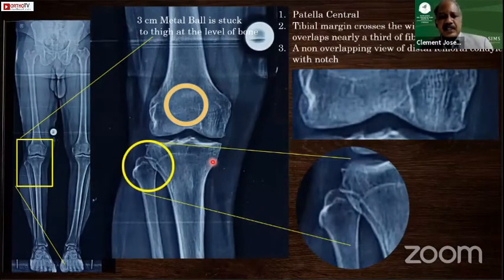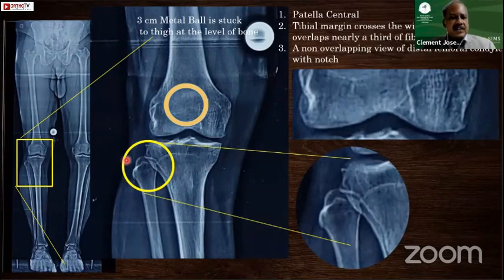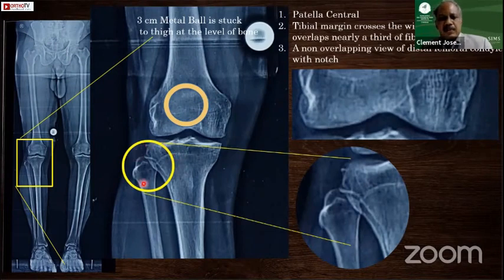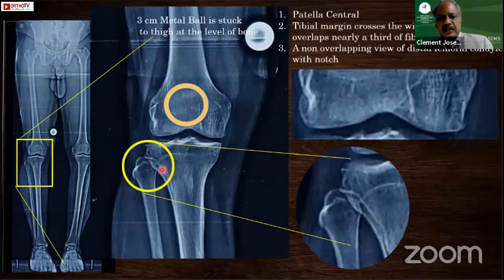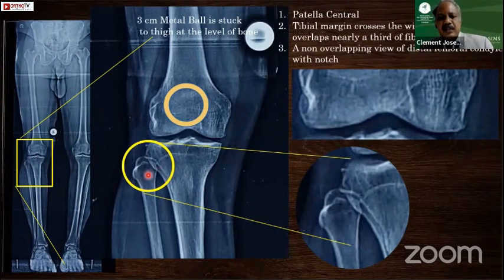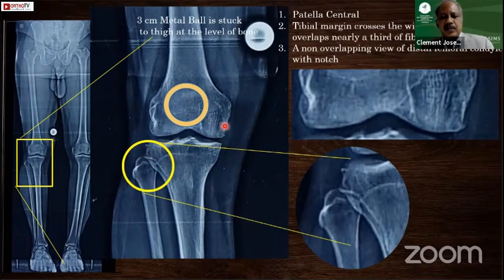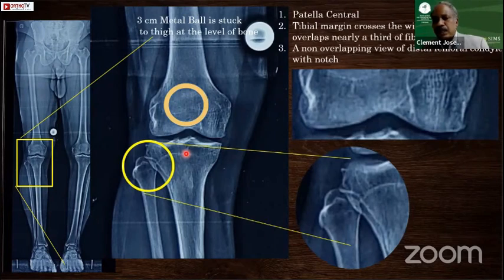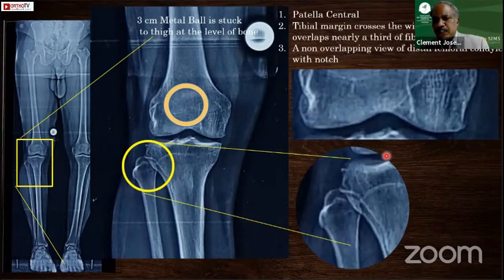Once the X-ray is taken, one should know how to assess if it has come out properly. First, the patella should be facing forward. Second, look at the tibiofemoral joint — one third of the fibula should be overlapped by the tibia. Third, the lateral border of the proximal tibia should cross the fibula at its widest portion. Fourth, the joint space should be clearly visible as an orthogonal projection. These points help identify if the X-ray has been taken properly — if not, all your measurements may be unreliable.